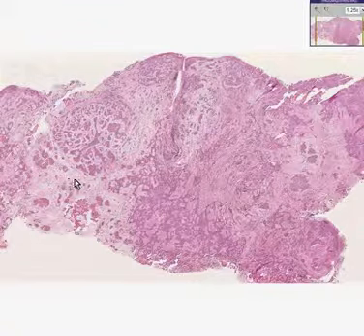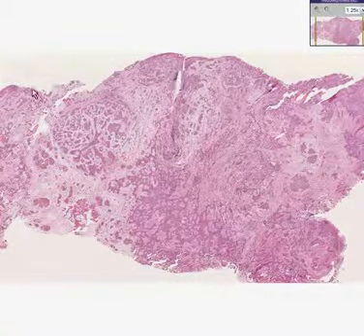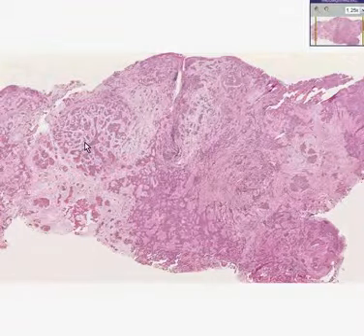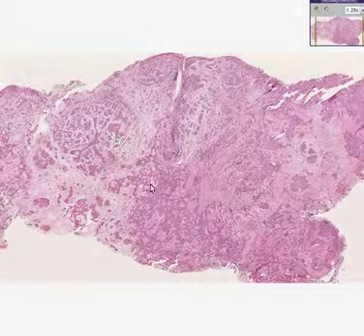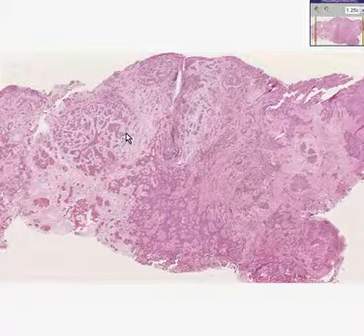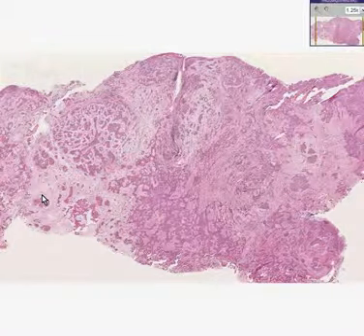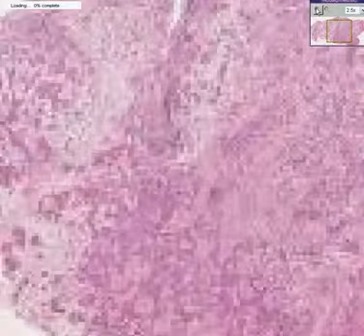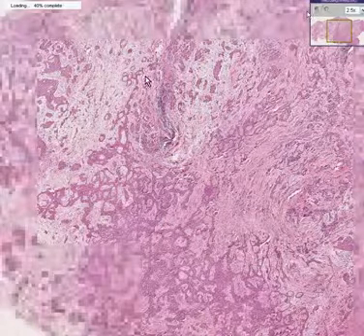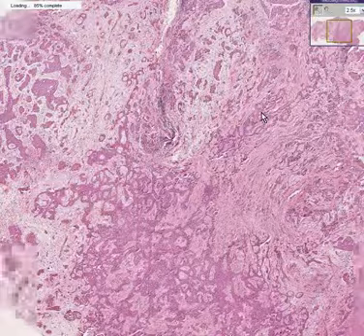Here is fibrous tissue, the whiter area. This whole thing is a pleural tumor. Here is a sort of infiltrating array, perhaps in a trabecular pattern, perhaps in a little cell ball pattern. Use whatever adjective you want because it doesn't matter as long as you're describing it honestly. And within this fibrous tissue, you can see infiltrating nests of mesothelial cells.